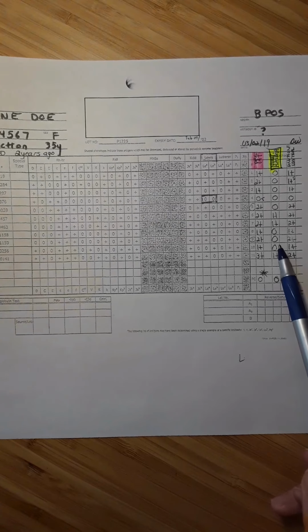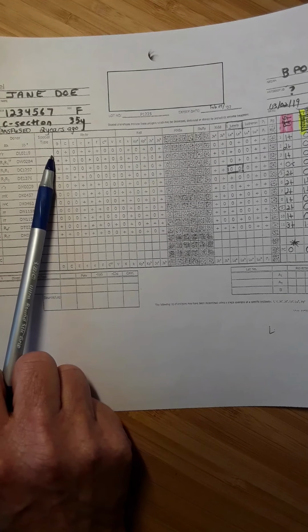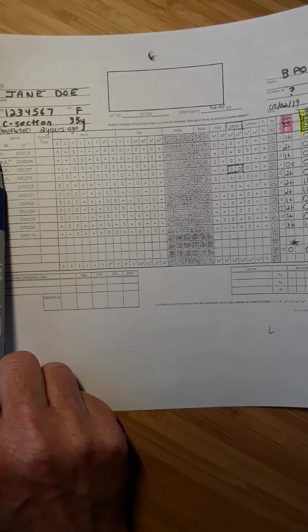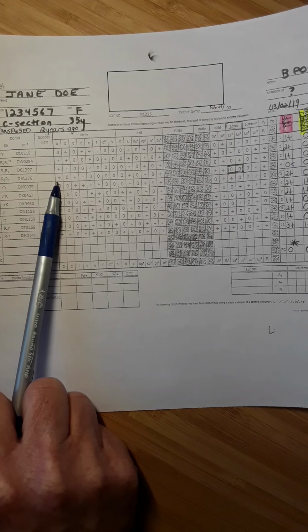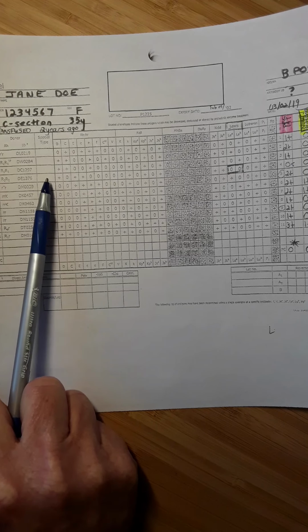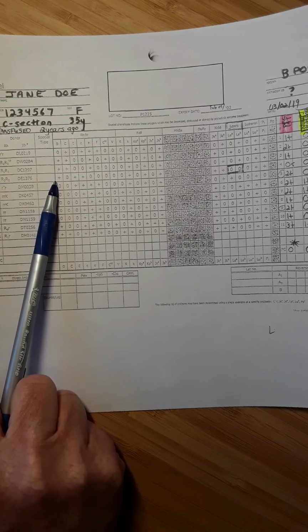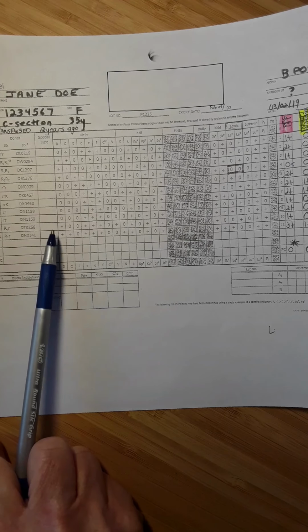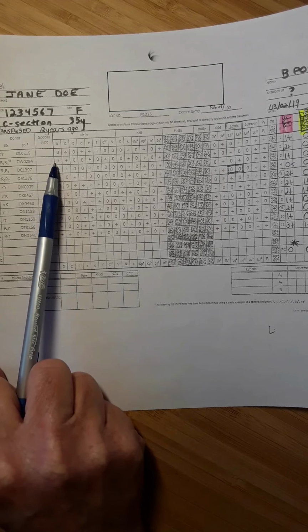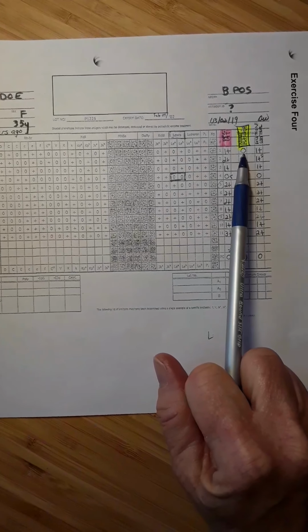So we look over at the columns underneath each of the antigens. So let's look at D. So under the D, we have a negative. This cell, panel cell 1, does not have the D antigen, but panel cells 2, 3, and 4 do. So if the patient's plasma contained an anti-D, I would expect that the patient's plasma would not react with the first cell, would with the second, would with the third, would with the fourth, would not with 5 through 9, and then would react with 10 and 11. This pattern, 0 plus plus plus 0 0 0 0 0 plus plus, is not the same as what I'm seeing here.